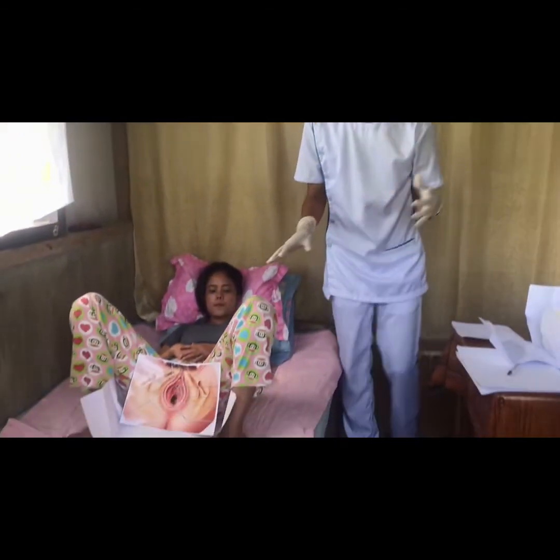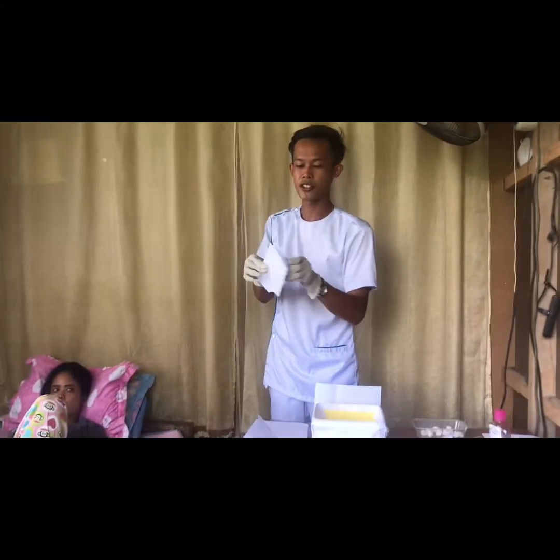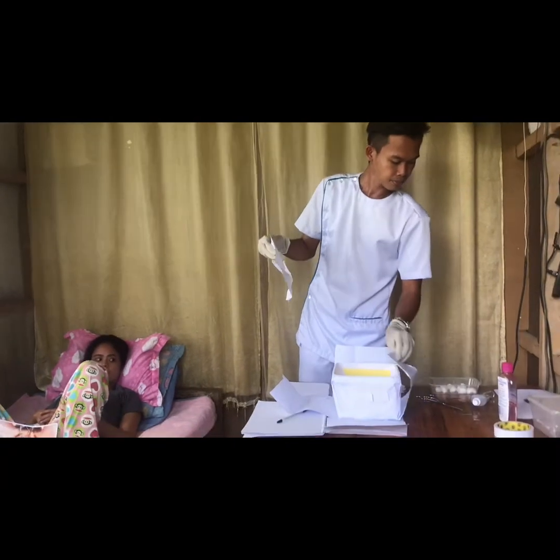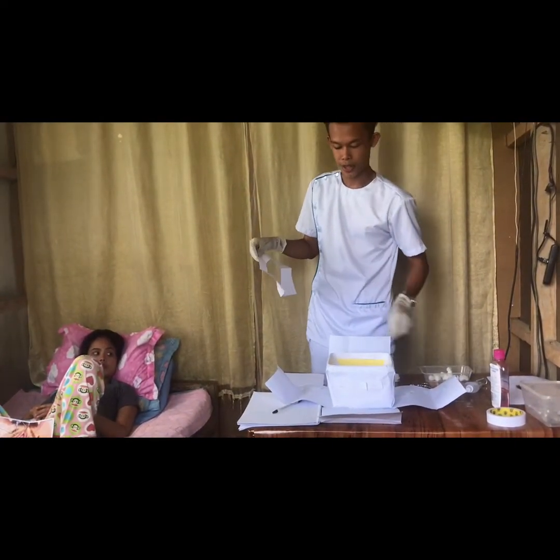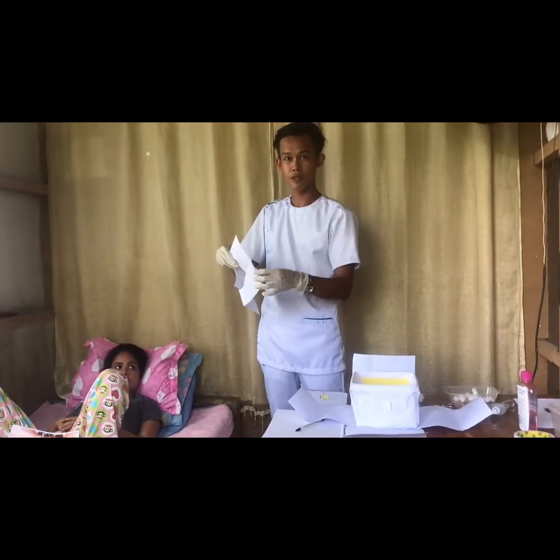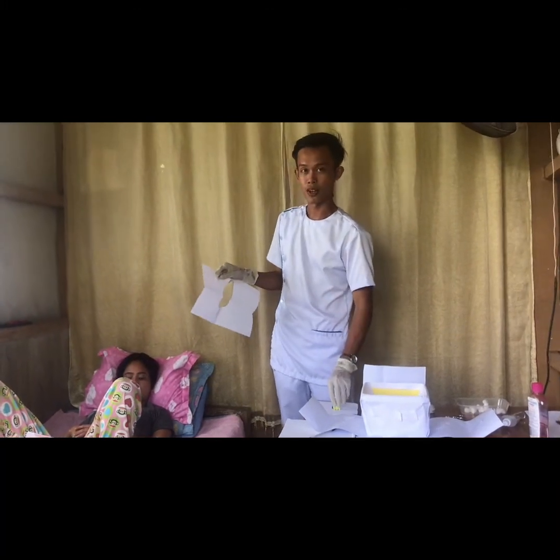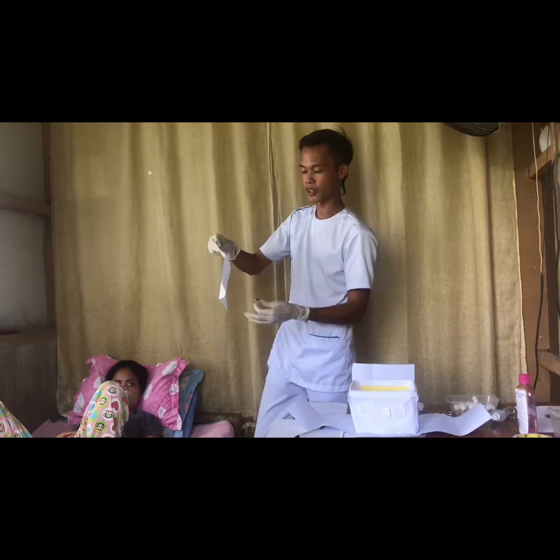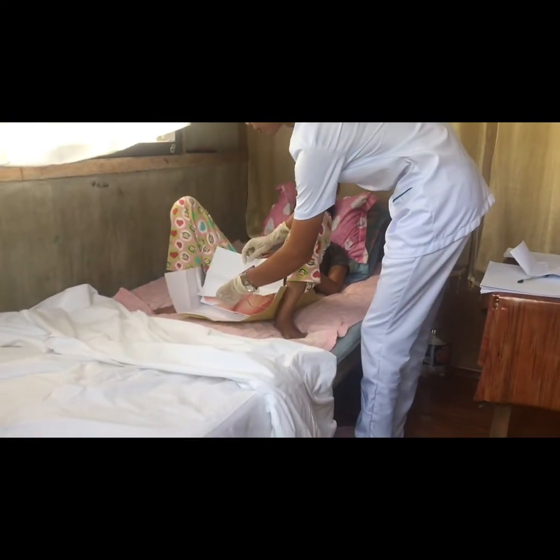So for this time, I'm going to grab the fenestrated drape. Okay, so this is the fenestrated drape. The purpose of the fenestrated drape is to provide more privacy for the patient, and at the same time to widen the sterility of the area. I'm going to attach it towards the center.